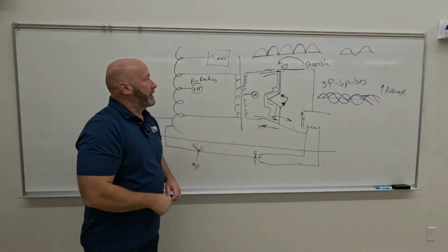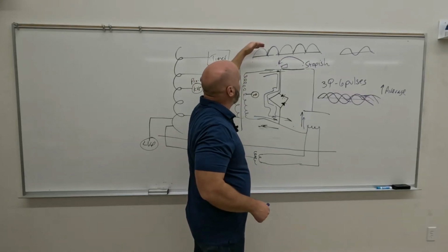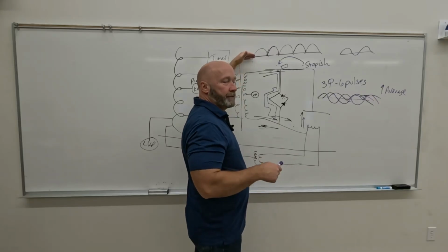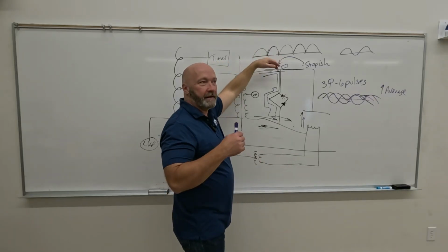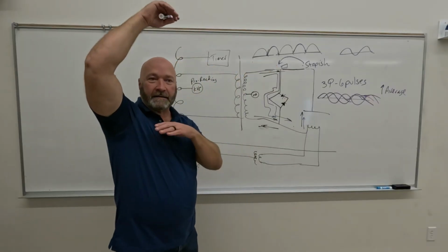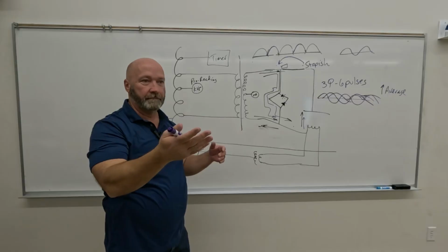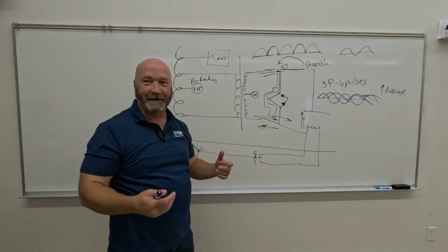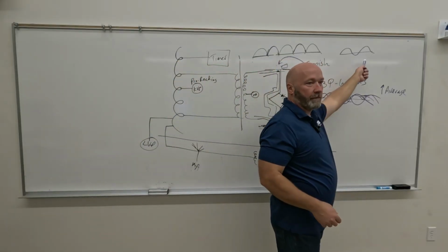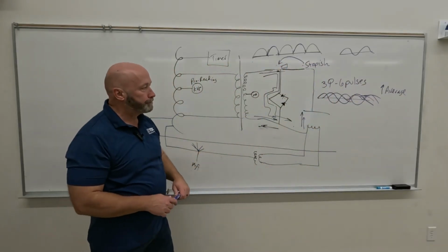As far as percentage goes, we refer to this as voltage ripple. If our voltage goes from peak energy all the way down to 0, what percentage of voltage ripple do we have with single phase machines, be they half wave or full wave rectified? It goes all the way from the highest down to zip. 100%. It's 100%, regardless of whether this is what we're doing or this is what we're doing. It's 100% voltage ripple with any kind of single phase machine.